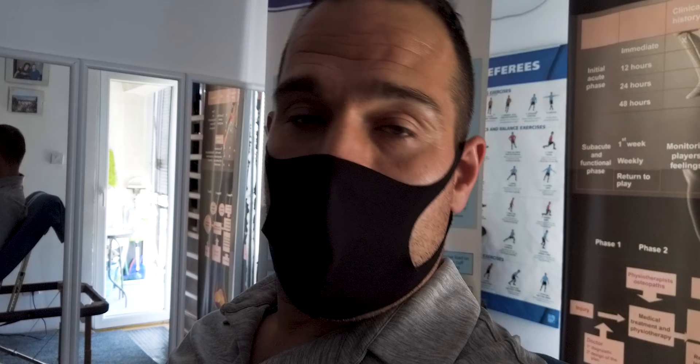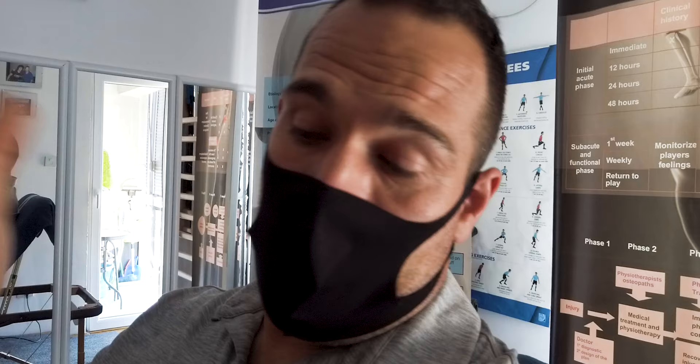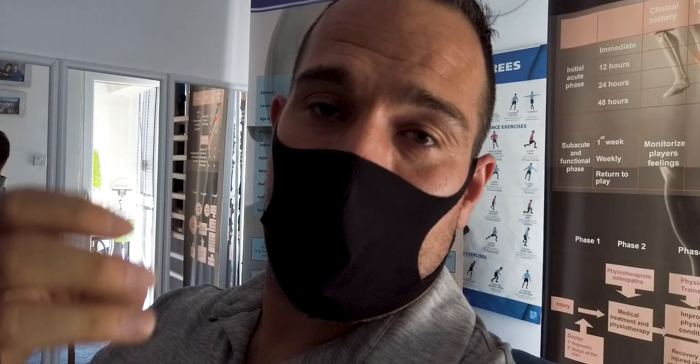Hey guys. So I told you I'm taking these therapy sessions for my knee. I injured my knee about three weeks ago and I'm on therapy session number four right now. With the right tools, everything works better. One of the cool tools that this physiotherapist has is an ice water machine that pumps ice water through a sleeve that goes over my leg, over my knee, and it compresses it with coldness for a good 15 minutes to try to relieve the pressure, the swelling, and also the pain. It's pretty cool. Check it out.